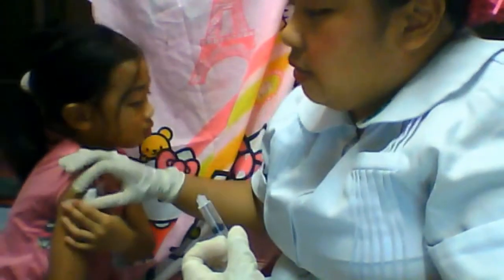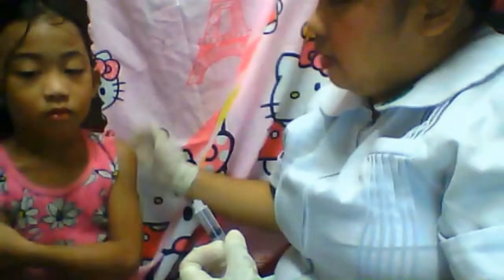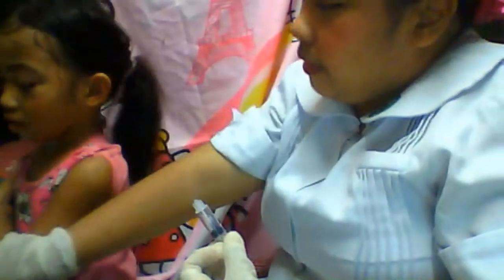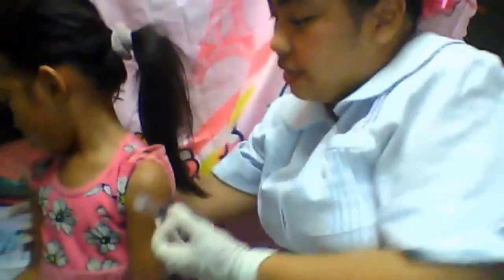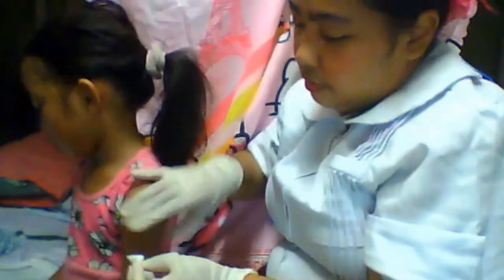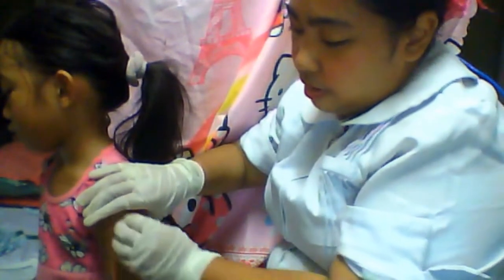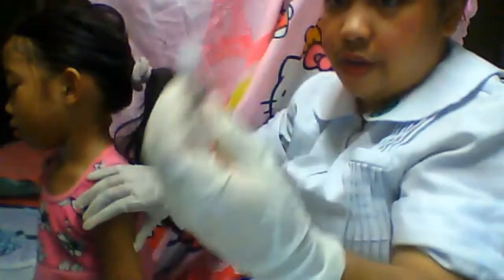Okay. Again, for safety purposes, we'll be using a needleless syringe. Okay, so ma'am, let's go on the other side, ma'am. Okay, so for example, this is the other side. This one is the other side. Again, same. Okay, you get your cotton ball, same location. Wipe and then discard. Okay, 45 angle.